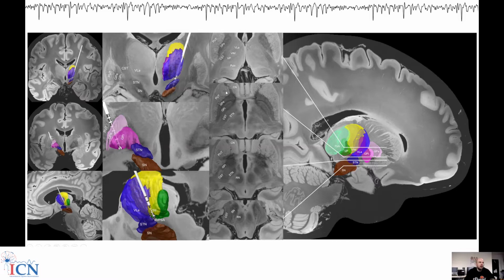So there are different deep structures that we implant in depending on the DBS indications, so the reason why we implant the electrodes. And it is good to know some of the anatomy to really understand the relationships of the recordings that we get from these electrodes. Depending on the depth, it is, for example, possible in the GPi trajectory to record additional GPe, and sometimes in the STN trajectory, on the uppermost contacts, you also have some thalamic activity. So it's good to know where exactly the electrode was, even if we don't look at that during the LFP analysis.